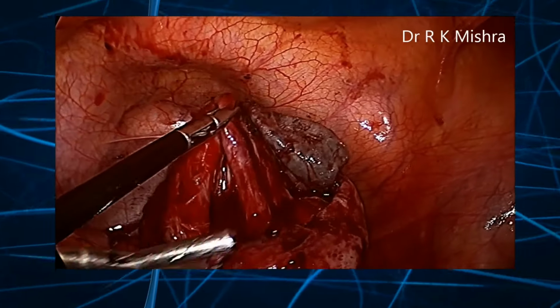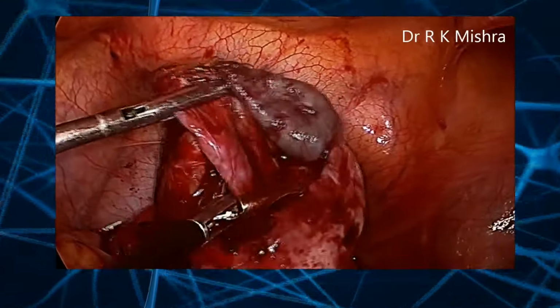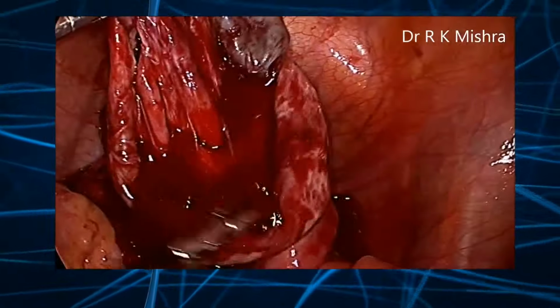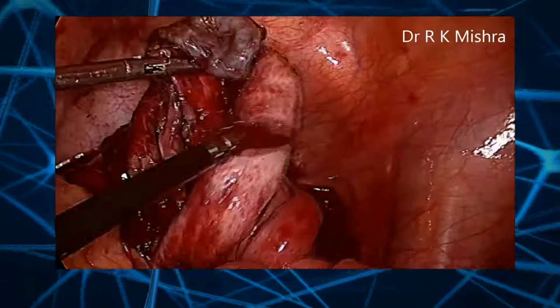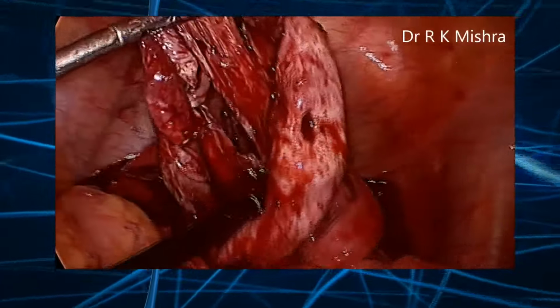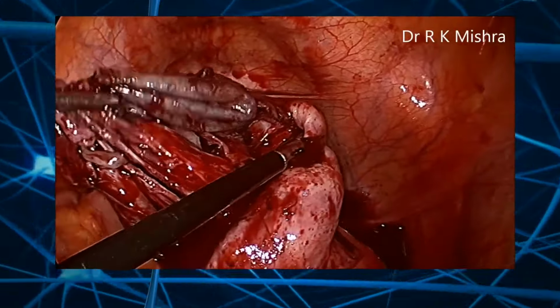Now, this is a traumatic grasper which is holding the cyst. If little oozing is there, do not do anything, just continue your surgery. It looks big in laparoscopy, but in reality it is not that much.